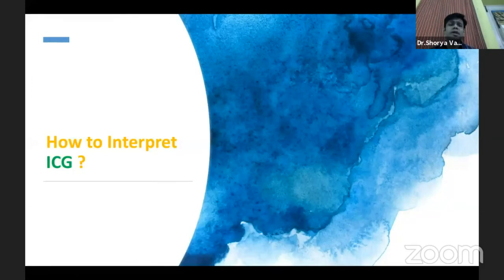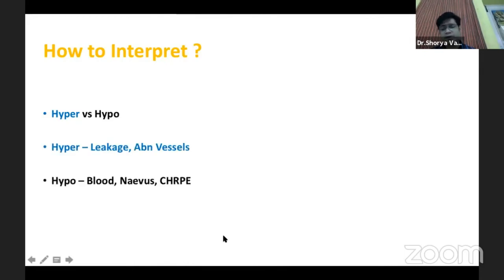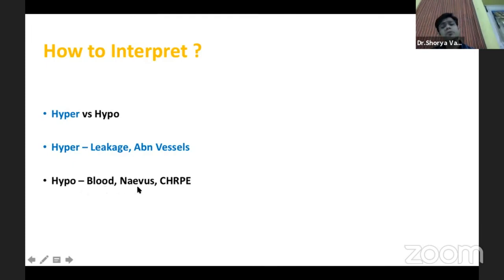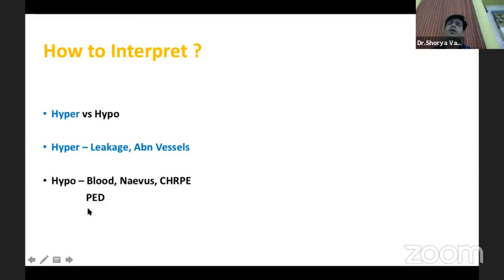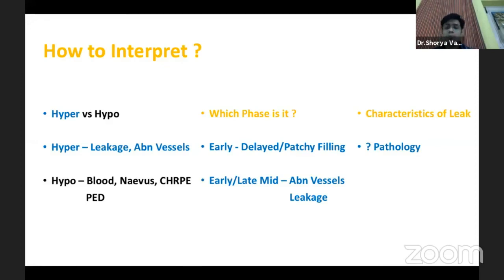Moving on to how to interpret ICG. It goes more or less along the same lines as FFA; however, the interpretation of hyper and hypo is a bit different. For hyperfluorescence, we are not going to assess for size and intensity because not much leakage occurs; instead, we look for abnormal vessels and any leakage in the late phases. For hypofluorescence, it is similar — for example, a choroidal nevus or CHRP blocking the underlying choroidal fluorescence — but a PED is different from FFA where it fluoresces; here it is hypofluorescent due to non-leakage of ICG.